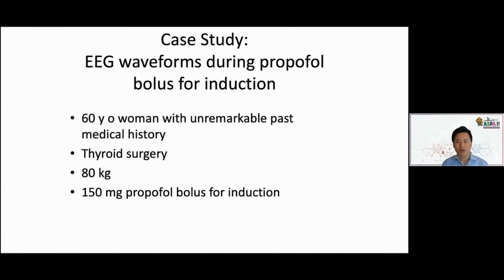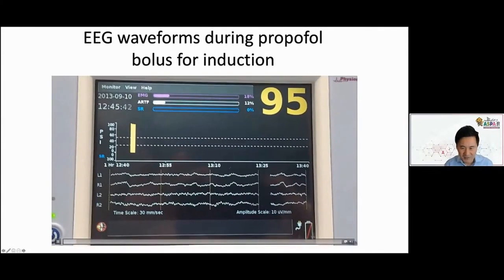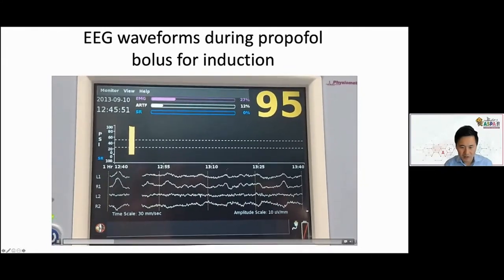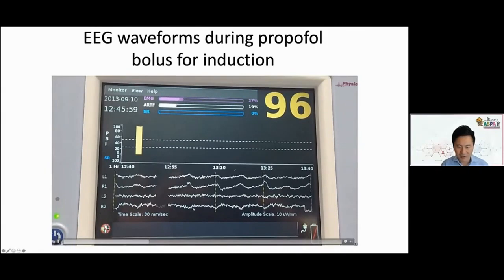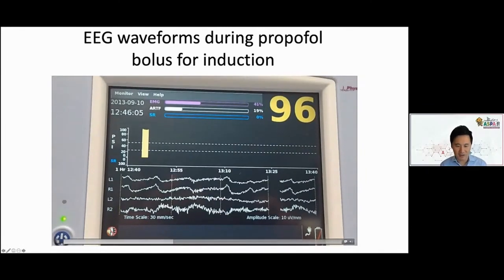So let's review again that case that I showed earlier of the waveform, just to get a little more practice visualizing the waveforms. It'll be important to look at both the waveforms and the spectrograms as you read out these EEGs. So let's look at this one again. Again, 4 seconds of time. Okay, the patient's awake. There's eye blinks here. Okay, and we start to see some muscle activity here. That's when the propofol is being administered initially, again creating that burning sensation.